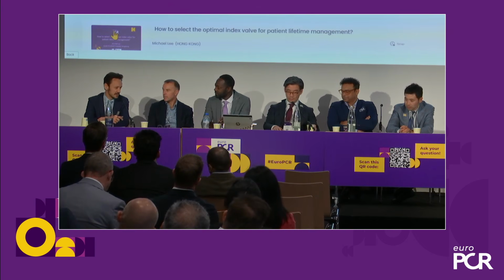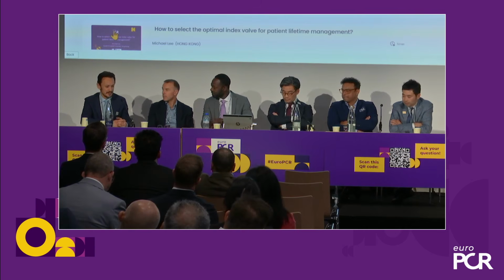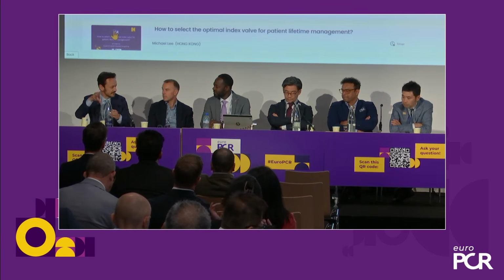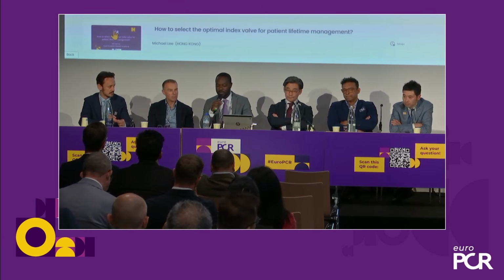I think explant is and will stay something that we will need because some valves get infected, they get thrombosed, they cannot just be treated by TAVI in TAVI. So explant will remain, but I don't think there is room to include it in lifetime management as something that you plan to do. Yeah. So, very clear message.